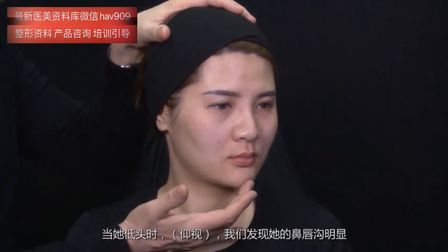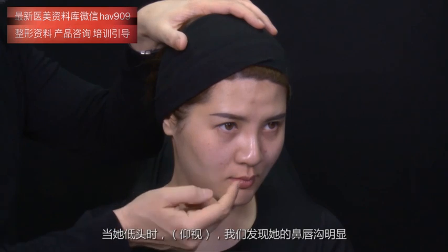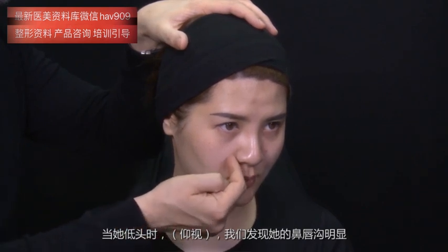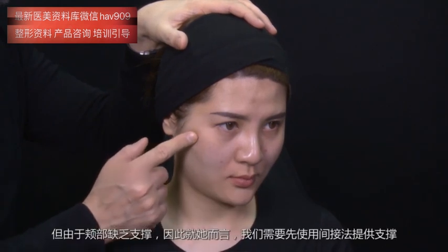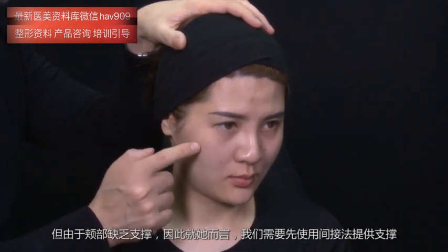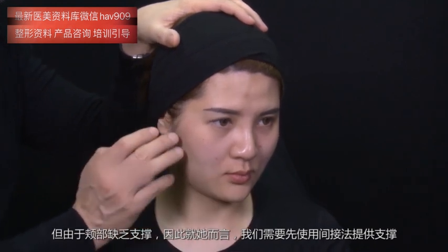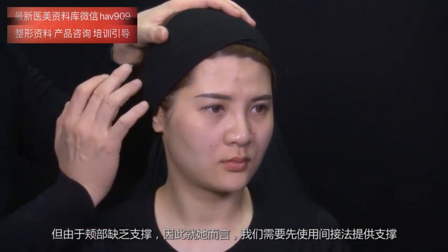When the patient tilts down, eyes up, we notice that the nasolabial fold is prominent, but because of lack of support of the cheek. So in her case, we need to give support and provide the indirect approach first.